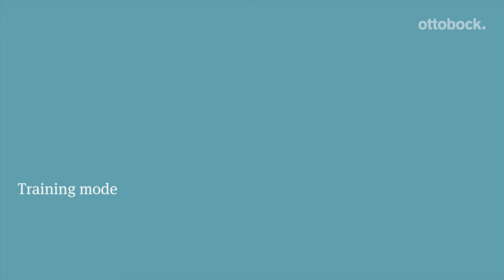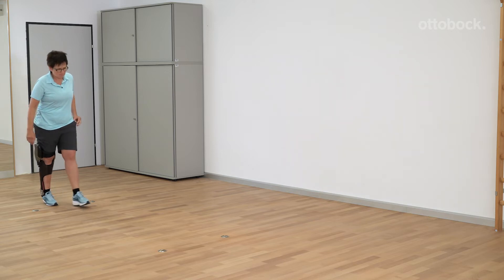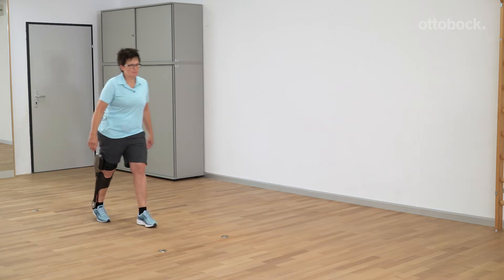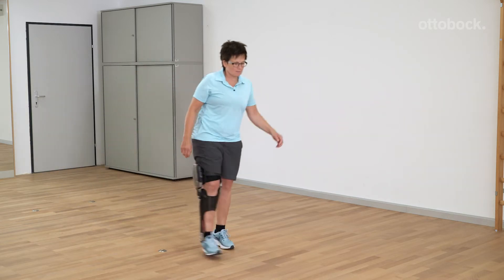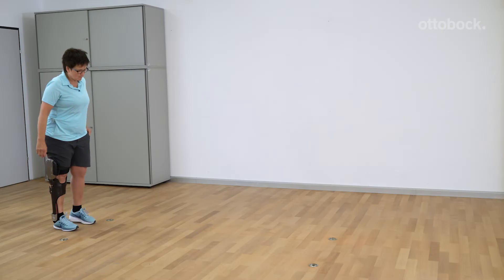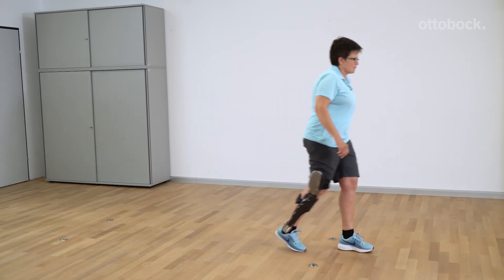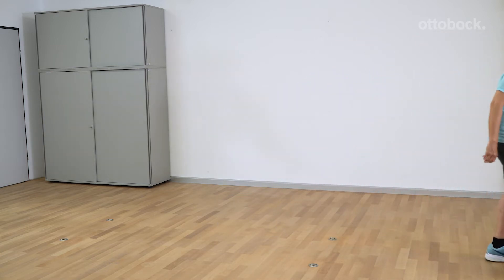Training mode is a good way for patients who previously used a stance control orthosis to get used to the C-Brace. The joint unit is locked in the stance phase and the leg with the orthosis can swing forward freely in the swing phase. Stairs and ramps can only be descended one step at a time in this mode. Stance phase flexion is not possible.